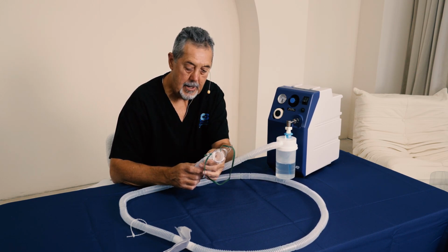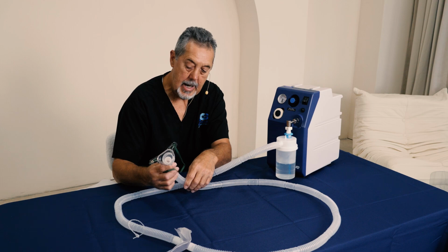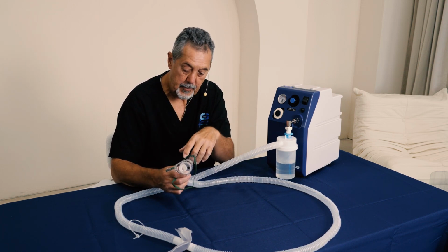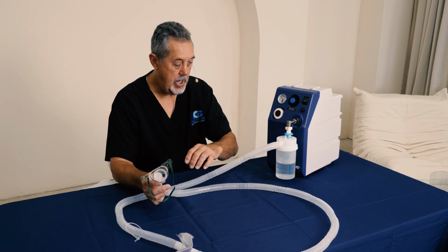And what I mean by that, we do not want the patient to rebreathe their CO2, so there has to be enough flow coming out of here so that they can dispel the CO2 that the patient is exhaling and provide a nice, comfortable flow of air with mist to the patient.